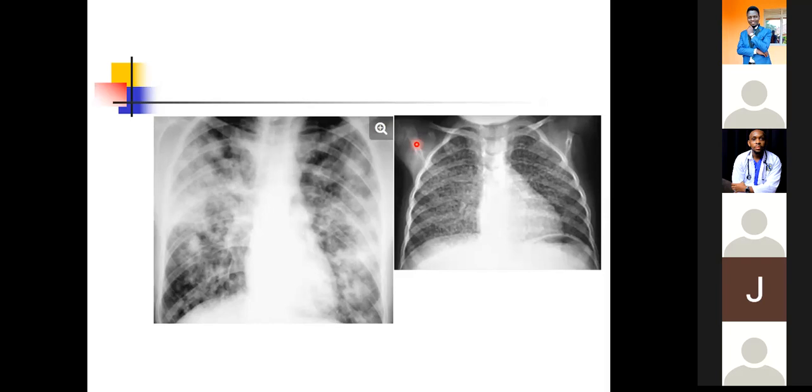And also remember, when you're dealing with CT images, there is no superimposition of structures, but when you're dealing with a plain chest radiograph, there is superimposition of structures. So it will be difficult for you as somebody in training to right away classify the kind of opacity that you're seeing, whether it is predominantly pleural-based or not, but with time, it is actually possible.